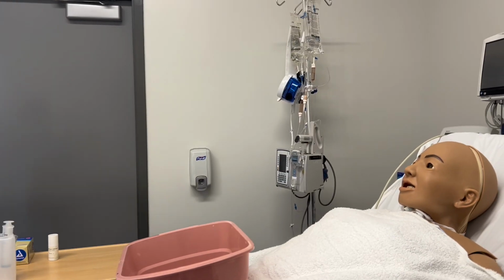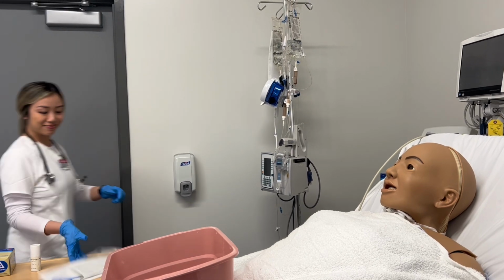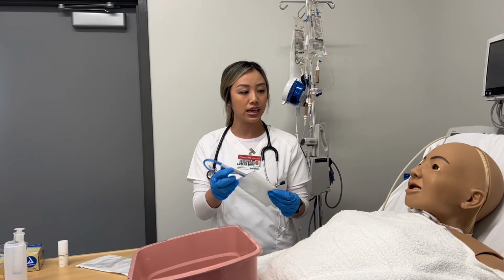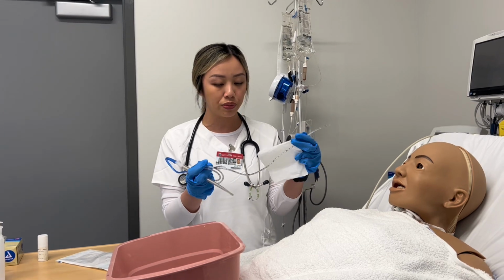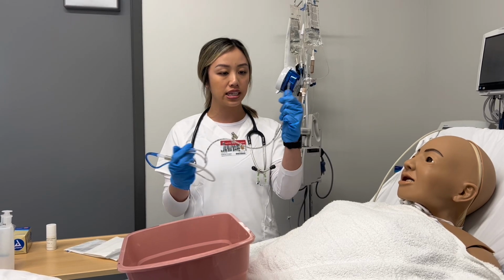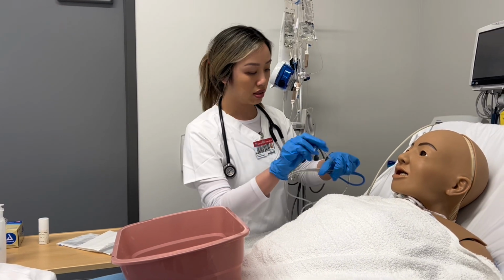Let me go grab it. So at this time, I'll pick the appropriate tube too. I see here that the nostrils are fair size, so we'll pick a 12 French. And I'm just going to assess the tube really quick to make sure there are no cracks, leaks, anything like that. I'm going to measure the tube now.